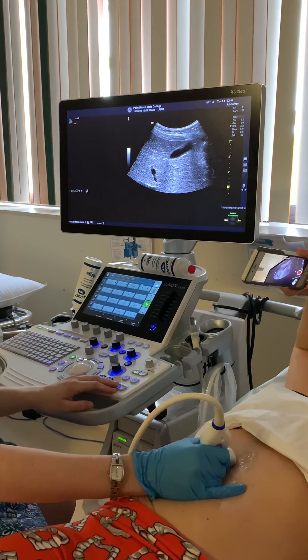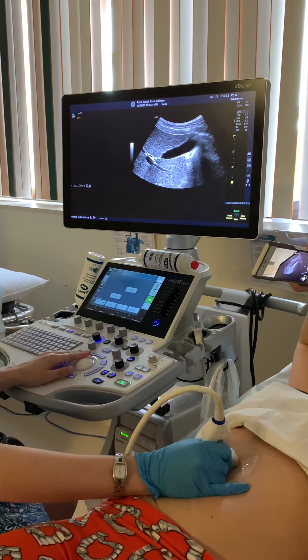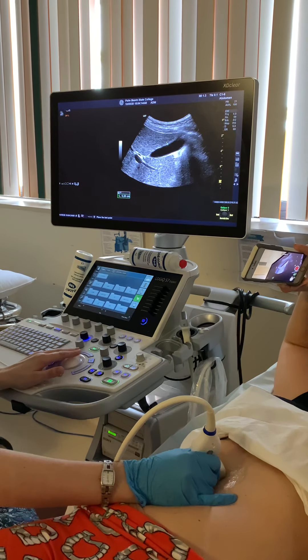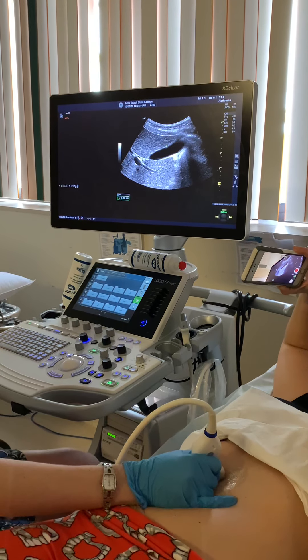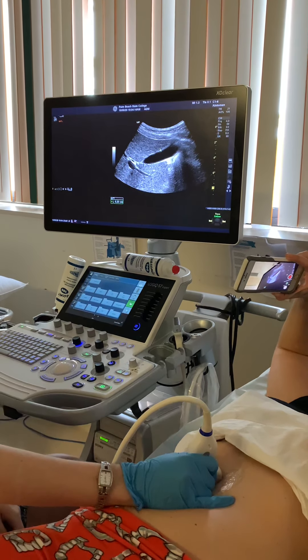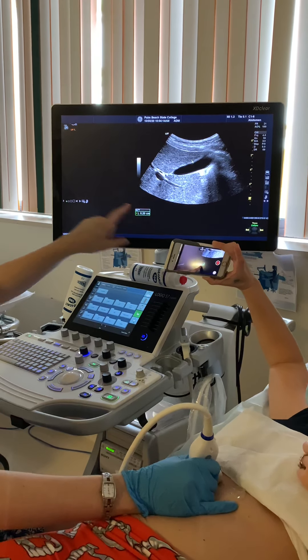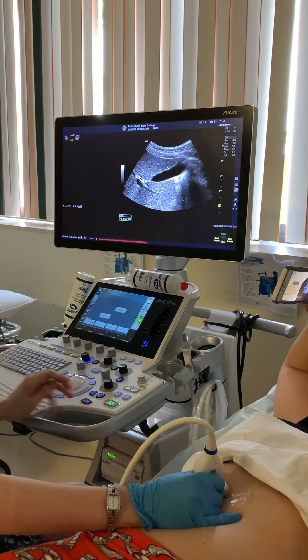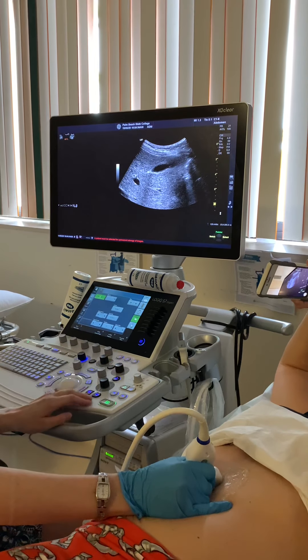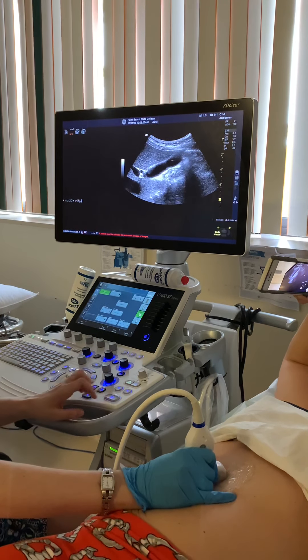We want to do three pictures through: lateral, mid, and medial gallbladder. At mid we're going to freeze our image — well, we're going to freeze for all of them — but at mid we're going to do a measurement of the wall. We want to measure the most anterior wall and it should be less than three millimeters. If it's greater than three millimeters, the wall is thickened, which can indicate pathology. We would freeze at lateral, freeze at mid for the measurement, then freeze at medial, and then the patient can breathe.